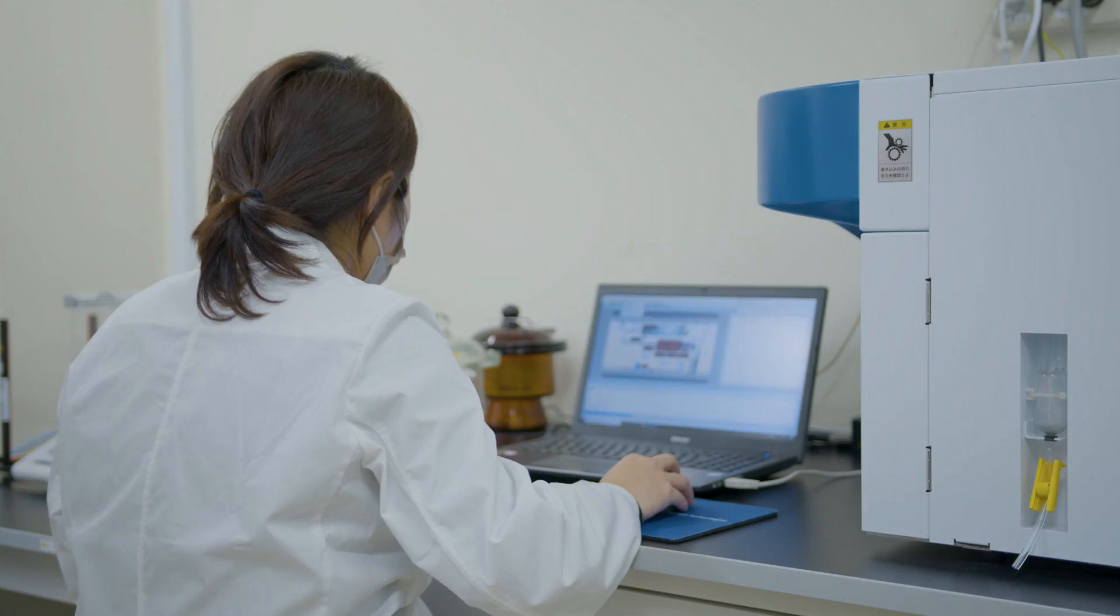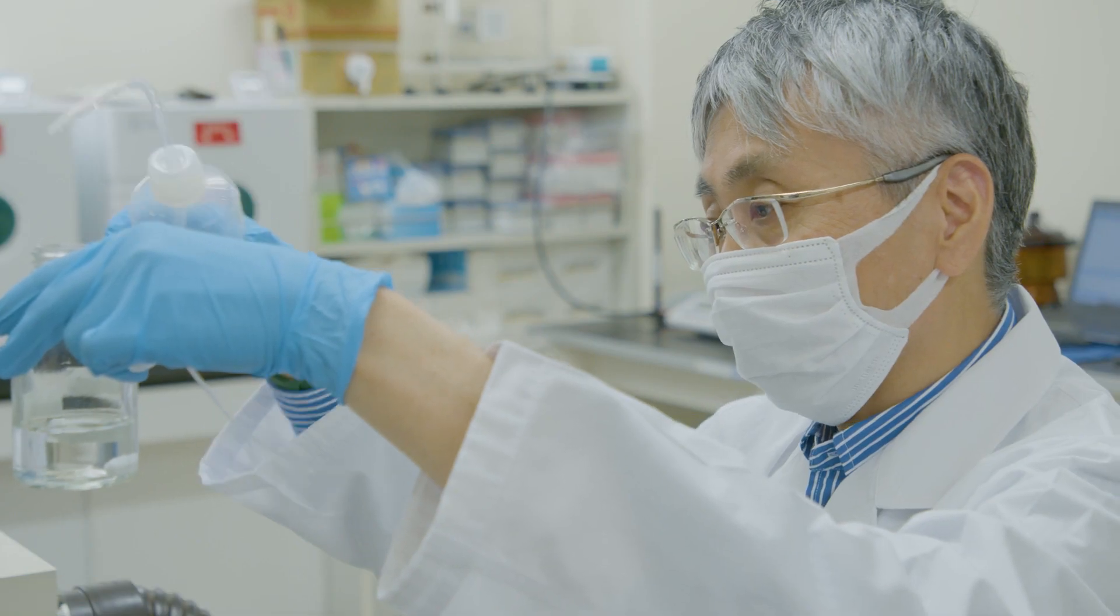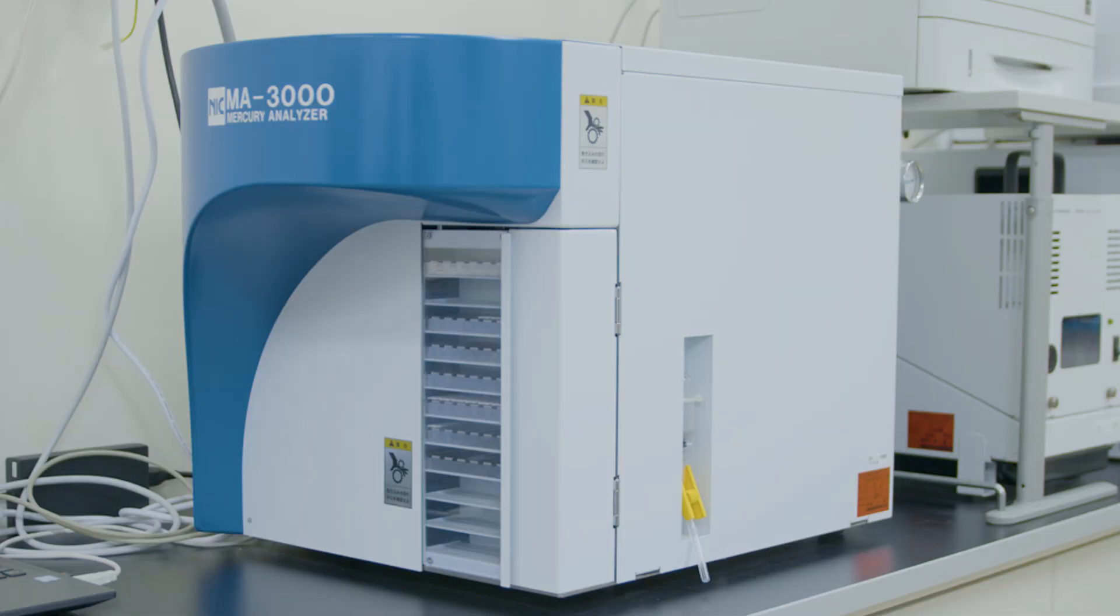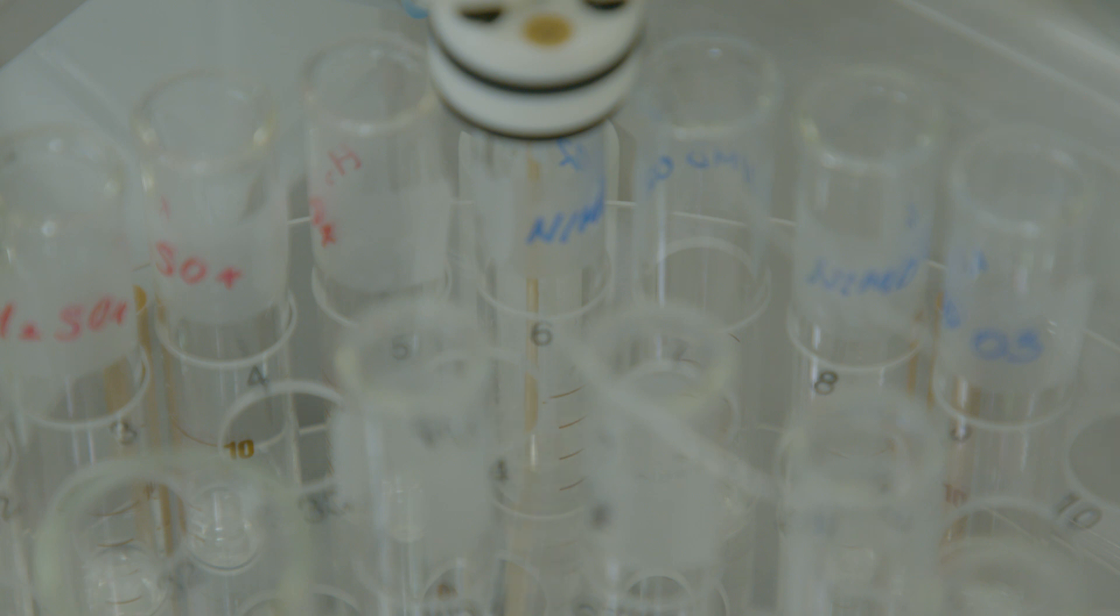Two of the most widely used methods in this proficiency testing are thermal decomposition atomic absorption spectrometry and cold vapor atomic absorption spectrometry. These methods are particularly effective for analyzing total mercury levels in human biomonitoring samples.